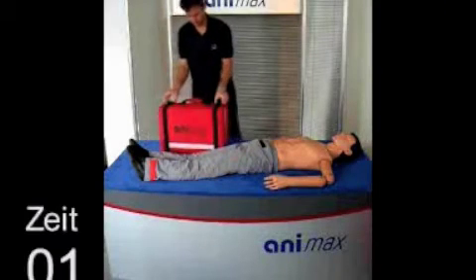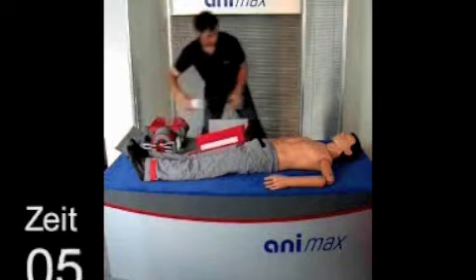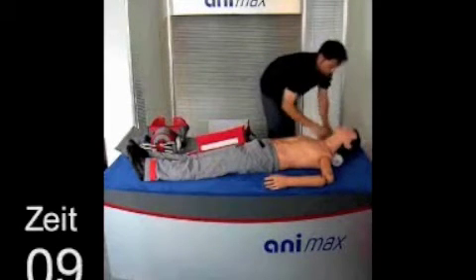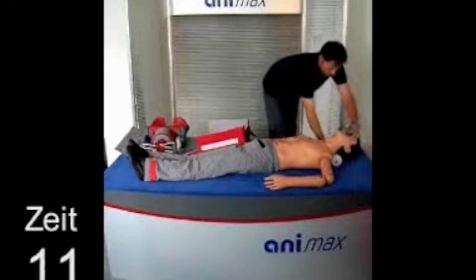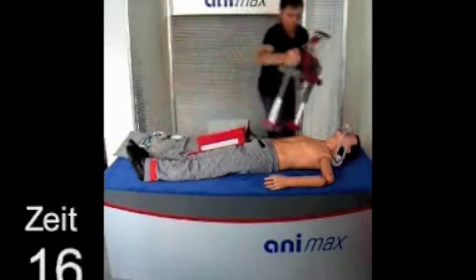It takes about 15 to 20 seconds to put the Animax on. First you put the spiro set on for ventilation. Set the patient's head on the overstretched pillow. The mask's hoops are hooked into the overstretched pillow to fix the mask securely. Then you put the Animax on the person's body.